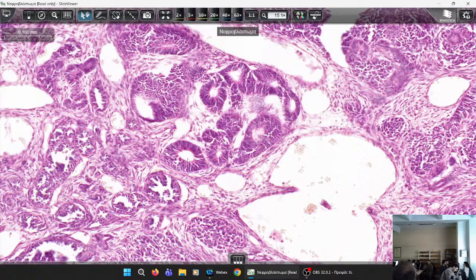What do you see? You see lumen in the structure. So what structures are they? The third component of Wilms tumor, of nephroblastoma, a common kidney tumor, mainly in infants. What is this? Since it makes lumen, what structure is it? Tubules, so it's epithelial, the epithelial component, yes.